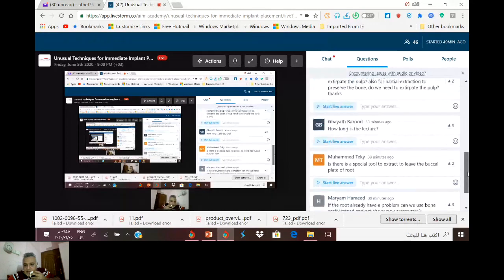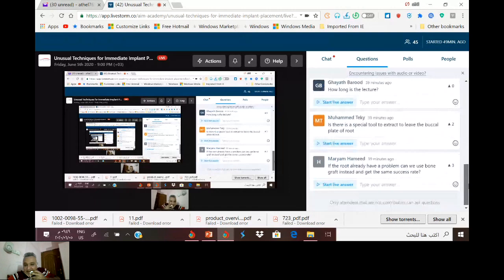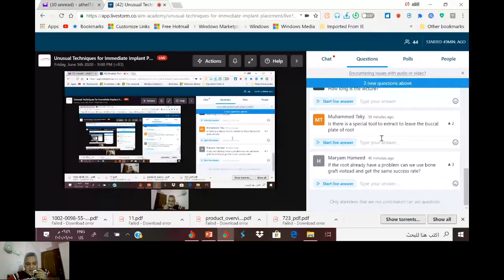Ghayath, how long is the lecture? It's 1 hour. Okay. Muhammad Taki, is there a special tool to extract and leave the buccal plate of the root? For me, I use a long shank turbine bur to cut the root, and after that I use remaining root forceps, and sometimes I use a special instrument which is a periotome to remove the palatal part.